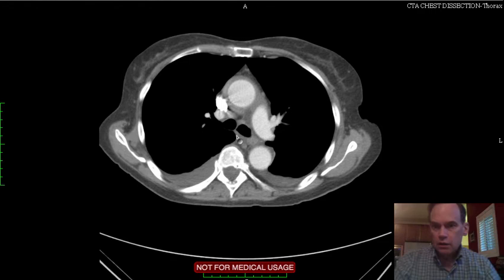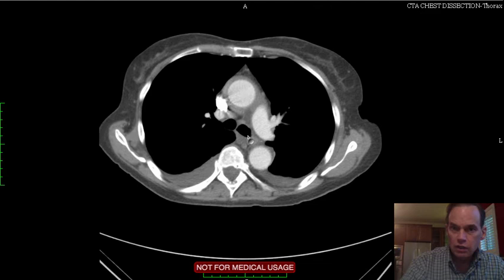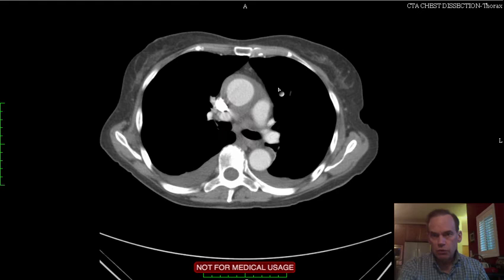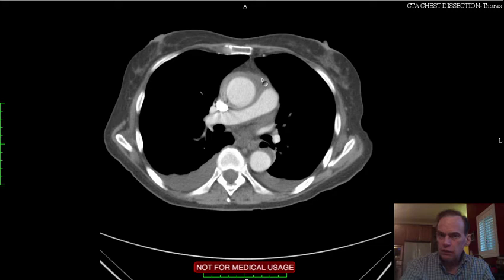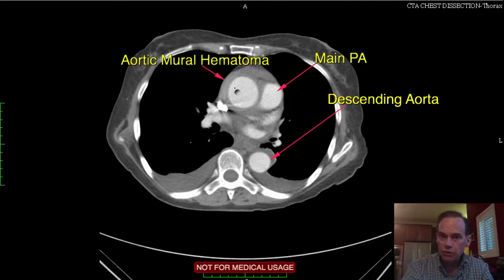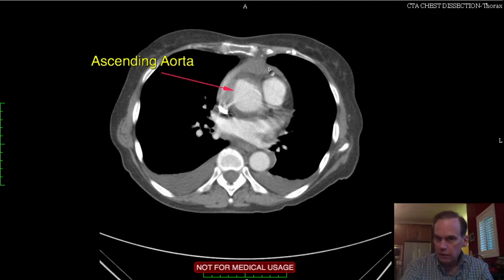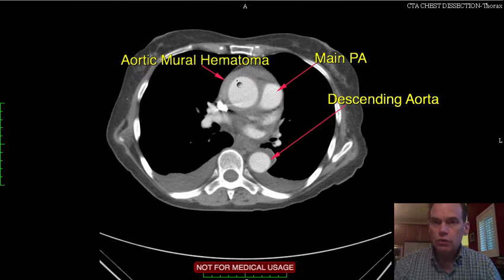Now here we see that high attenuation within the wall of the ascending aorta, and that is a mural hematoma — an aortic mural hematoma. Very rare. Only case I've ever seen. Not only is it a mural hematoma of the aorta, but it has extended, as we saw before, into the pericardium. So it has broken through the exterior margin of the wall of the aorta, and some of the blood that was accumulating in the wall is now emptying into the pericardial sac.